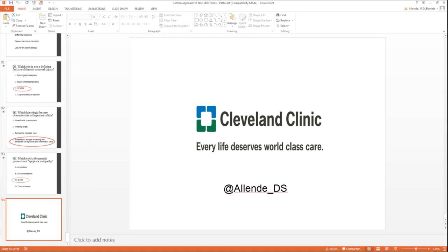If you see, for example, in the differential of Crohn's disease versus tuberculosis or any mycobacteria, I would say if you see too many granulomas, and in particular if they are necrotizing, that's not very typical of Crohn's disease. In fact, Crohn's disease has granulomas, but up to 30% of cases will have granulomas. So commonly we don't see a lot of granulomas in Crohn's disease. So if you have too many, it's too good, I would say consider an infection. So it's having a certain level of suspicion that will lead us to order these stains.